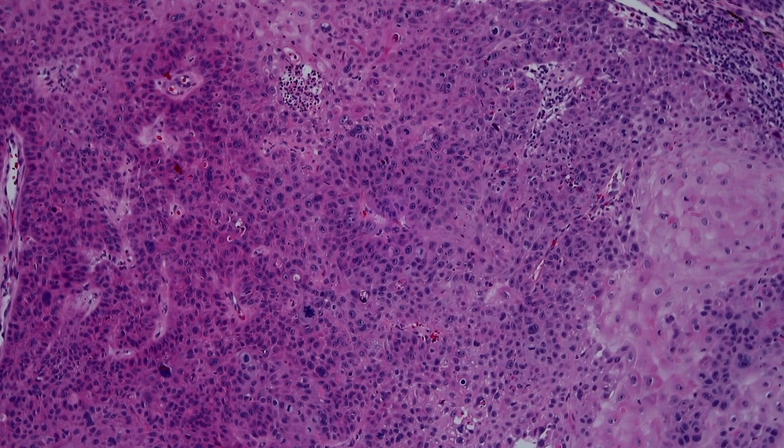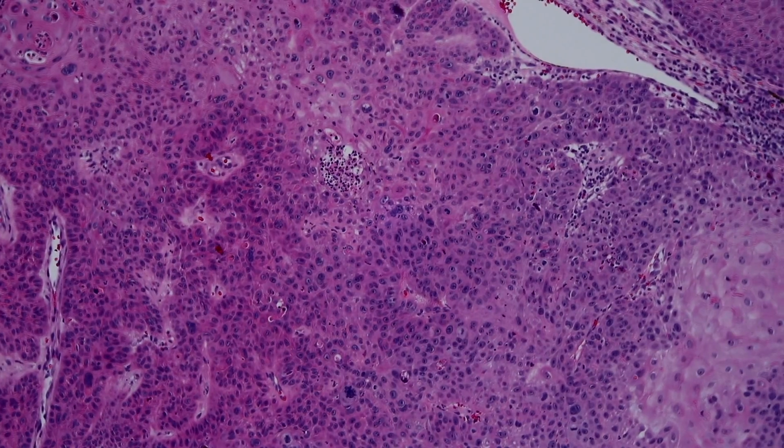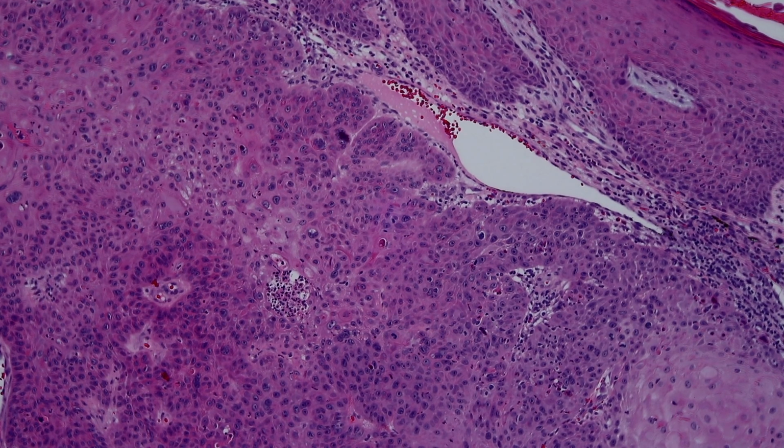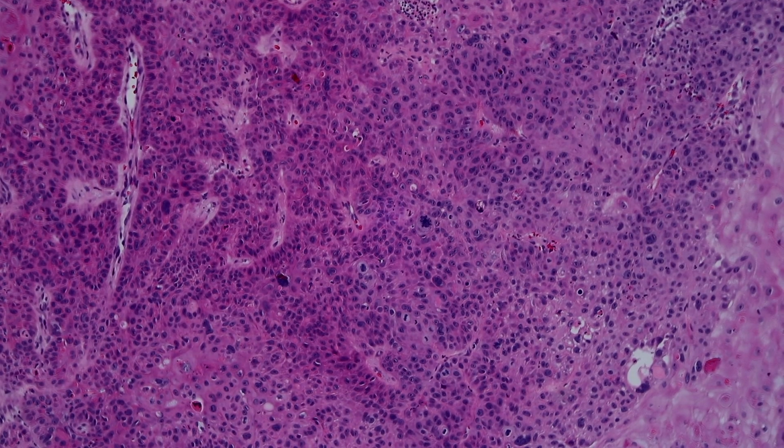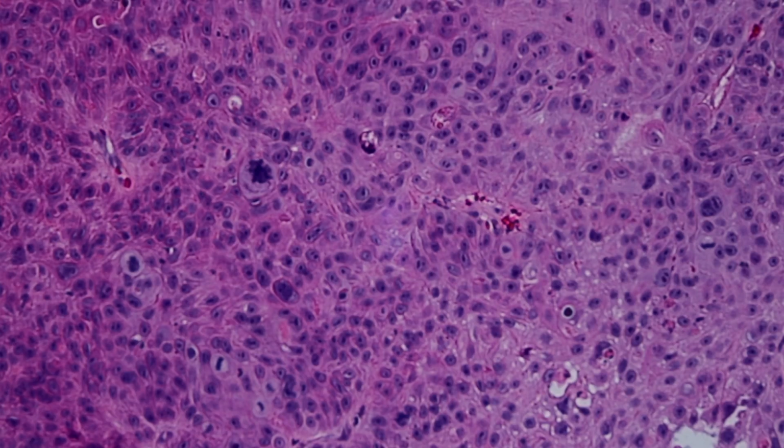And I've seen squamous cell carcinomas and melanomas get mistaken for one another. I've seen that those kind of mistakes can happen. And so it's important to think about that even though usually it's easy to tell this apart on H&E, there are times where squams can mimic other tumors and vice versa, and that can really have a dramatic impact if there's a misdiagnosis. So it's important to do anything that we can to help avoid that risk. And if I see something that I think might confuse someone else in the future, then adding a comment to explain that is probably a nice thing to do and might potentially improve patient care, I think.